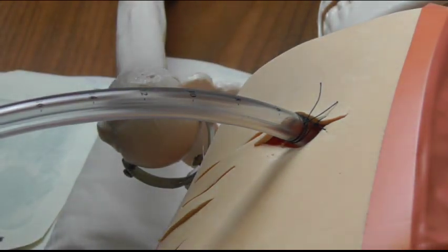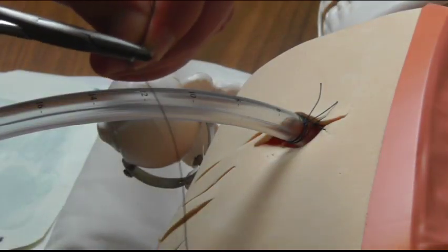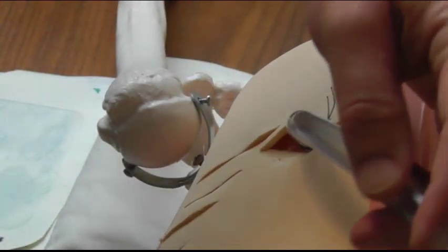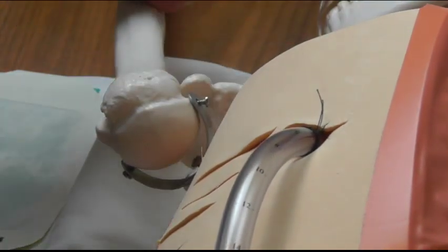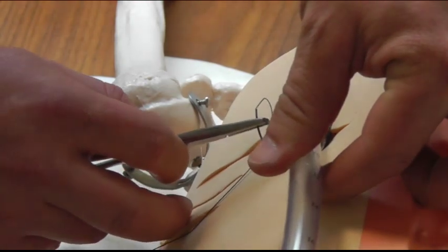Then what you want to do is go to the other side of the wound. So you grab your other stitch material out. Just go to the other side. I forgot to say, sorry, that's the head of the patient. You can see his face up there. That's his feet. This chest tube's in the right side of the chest.